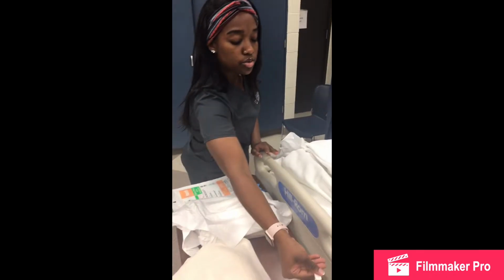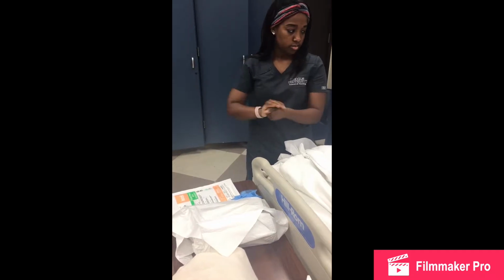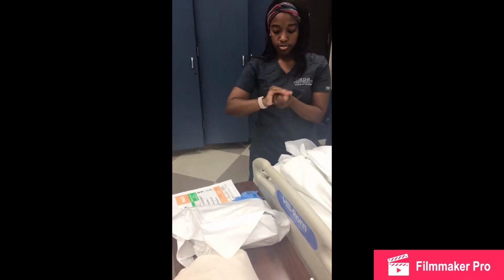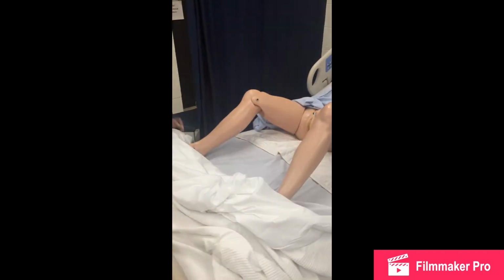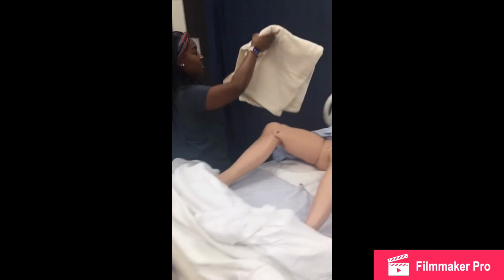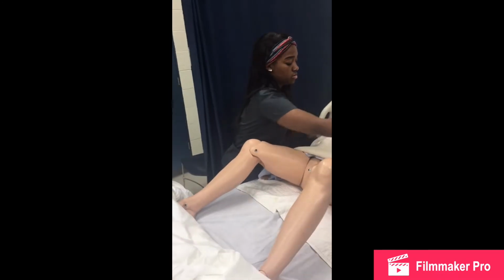Next, I'm going to wash my hands. And I'm going to start setting up my sterile field. I also brought a bed blanket for a little bit of extra comfort for my patient.